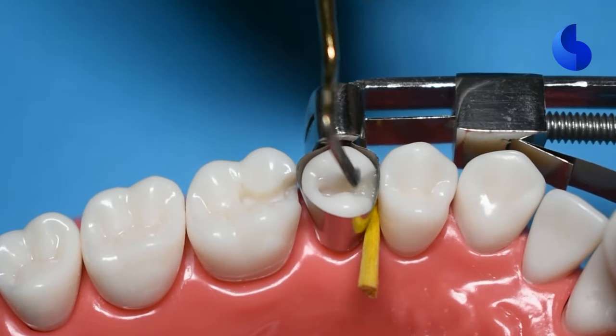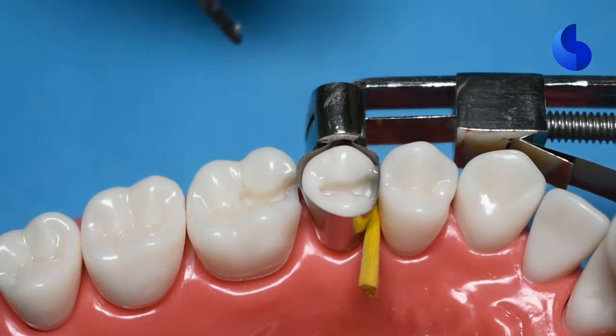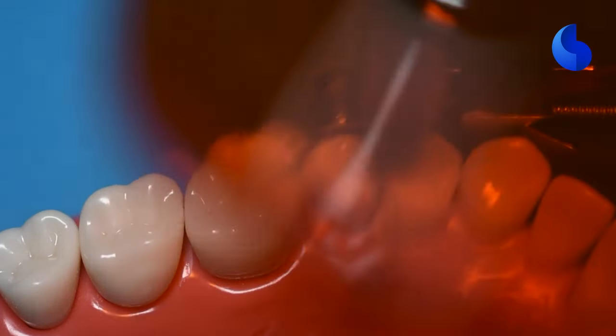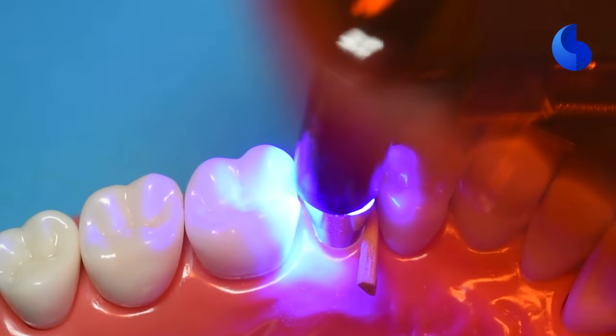So we like to fill this area first and create our wall before we start filling our occlusal part of the cavity. It's kind of like creating your own class 1 cavity so that the whole process becomes easier. After we have this layer in place, we'll go ahead and cure this as well.